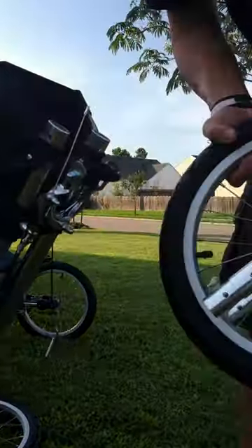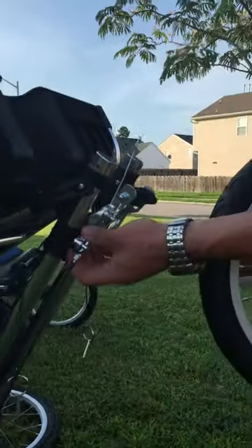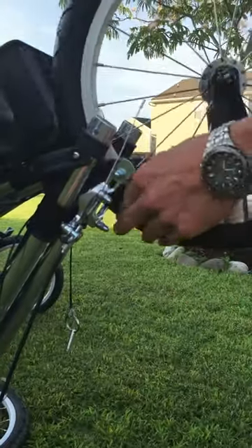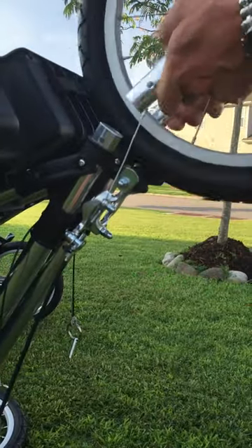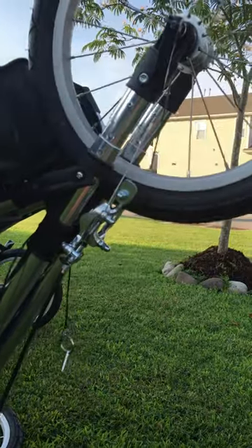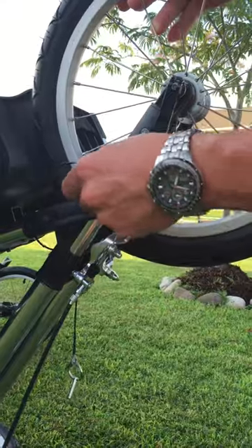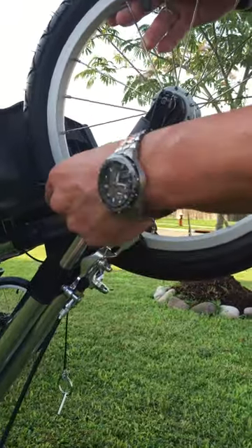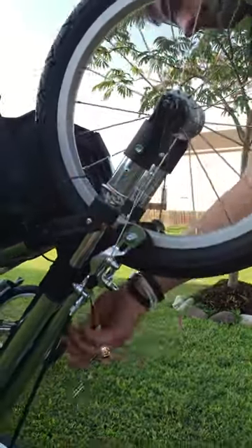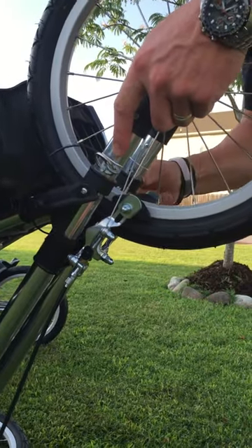Then we're going to come to the front. I always like to have this little thing on this side, which is fine. Then we want to unsecure this brake so that it's loose. We'll put that through and line these guys up and pop them home. Done. Then we'll lock the brake back up — easy day. We'll take the pin and go right back through the hole. Same thing on the other side. At this point, we've got the front assembly put together.